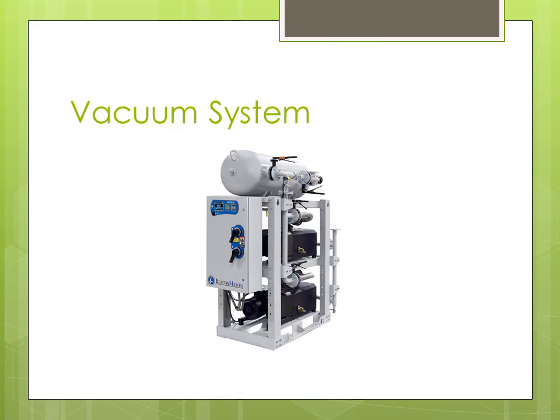Vacuum systems, similar to medical air, being that they're pumps and motors and storage tanks, have one other very interesting special consideration you have to be very mindful of depending upon what type you have. And that is, if you have a water-cooled system, obviously if you were to lose water in your building for any reason, then you could lose your vacuum system. And sometimes folks don't realize that they can lose vacuum. And vacuum really is one of the most critical systems, especially for suction and for other medical clinical applications. It is used very frequently in surgery, OR.